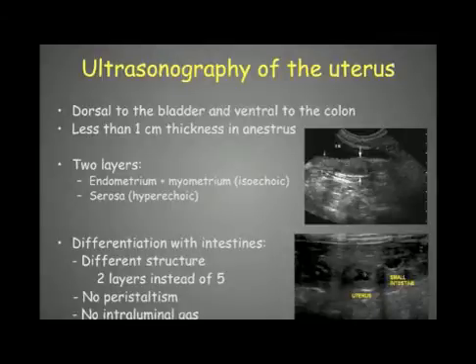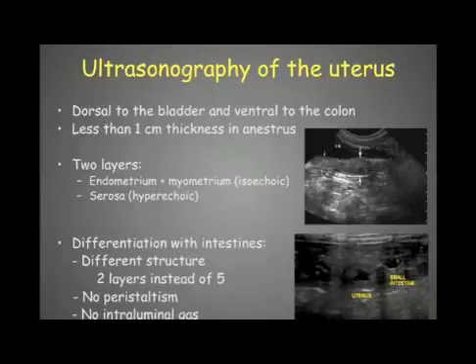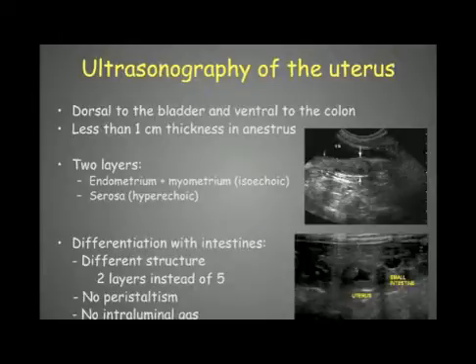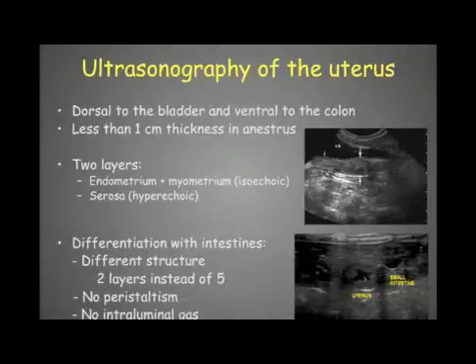In this uterus there is a bit of fluid in the lumen. To differentiate the uterus from the intestines, we look at the wall structure: the uterus has two layers, while the small intestine has five layers — the mucosal interface, mucosa, submucosa, muscularis, and serosa. We can also look for peristaltism, which is present in the small intestine but not in the uterus. Normally there is no intraluminal gas in the uterus, though some gas can be seen in certain cases of pyometra.